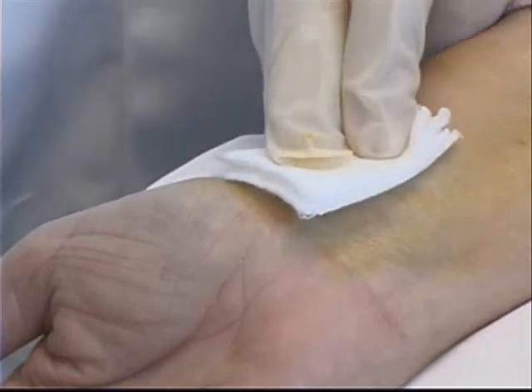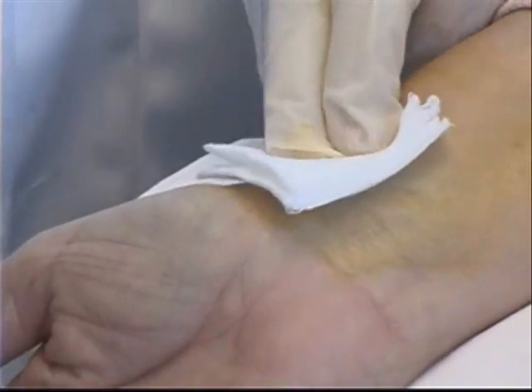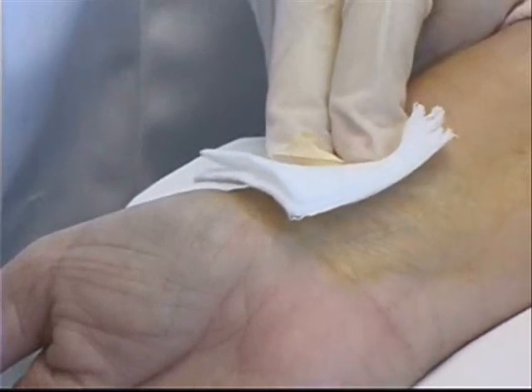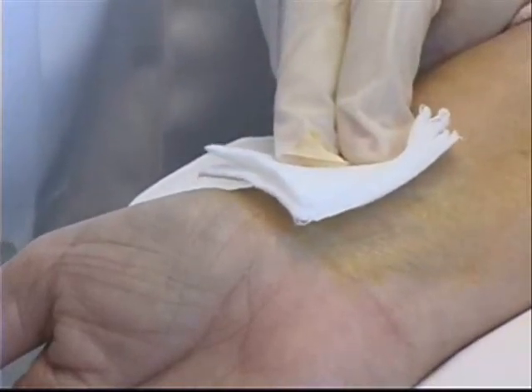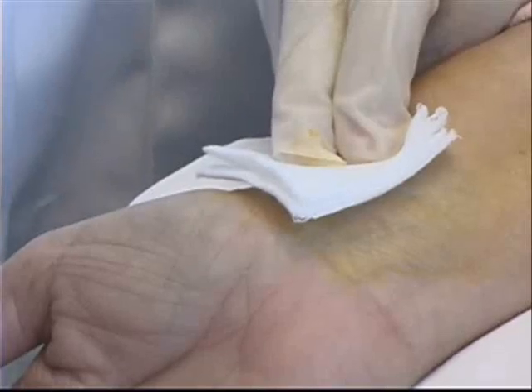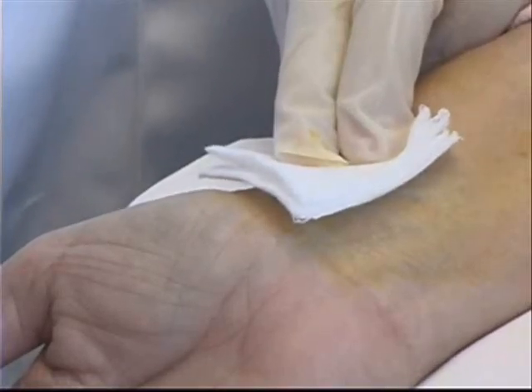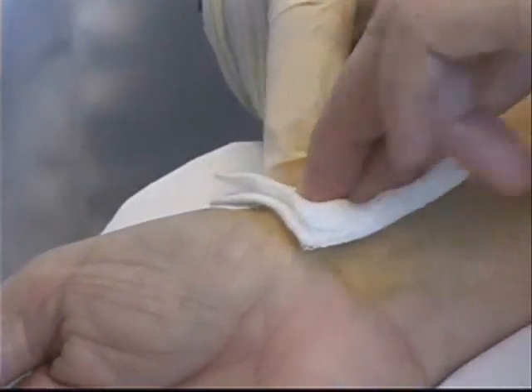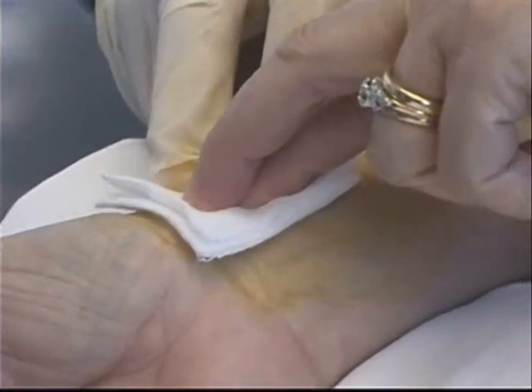I can either apply pressure myself to the area for approximately five minutes — or ten minutes if the patient is on anticoagulant therapy. If my patient is cooperative, I can ask her to please apply pressure over that area until I come back and tell her otherwise.